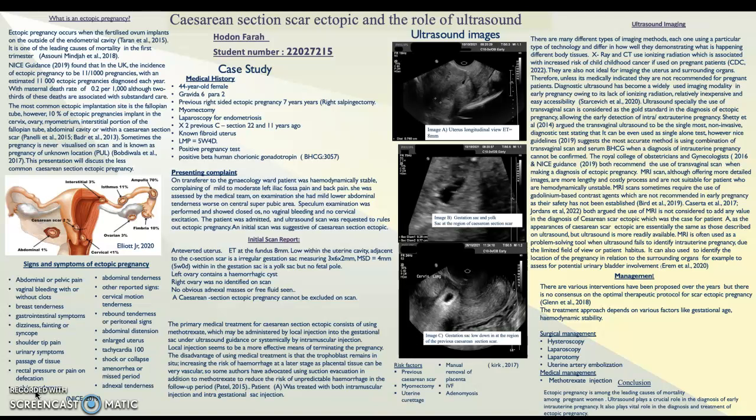When performing an ultrasound scan, it's important for sonographers to follow guidelines and code of practice set out by the Society of Radiographers and the British Medical Ultrasound Society 2021, which covers confidentiality, patient dignity, infection control, safety, ethical, legal and professional issues. Upon meeting the patient, it's important to introduce yourself and inform the patient of your role as a student and gain consent to perform the scan under supervision.